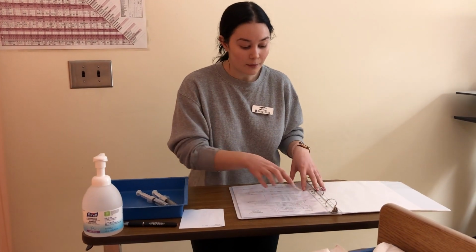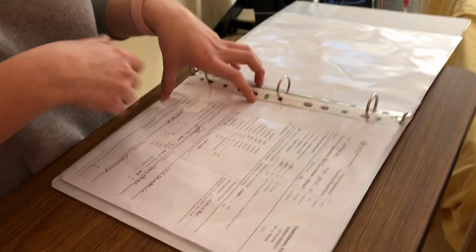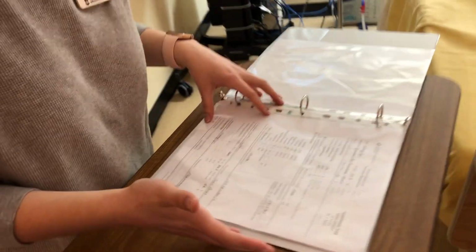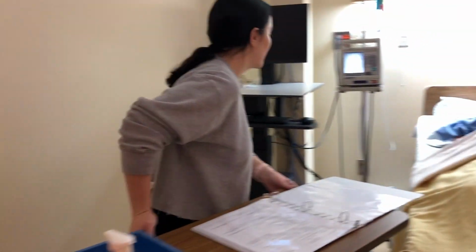My name is Annalisa. I'm going to be demonstrating how to administer TPN and then also how to do dressing change, suctioning, and changing the inner cannula. So my patient is getting TPN because they have squamous cell carcinoma of the throat, so they need to get nutrition through the vein. Okay, so the first thing I'm going to do, hi Fred, my name is Annalisa.